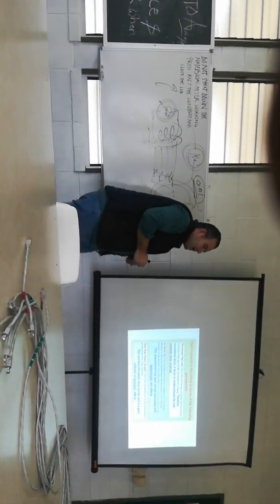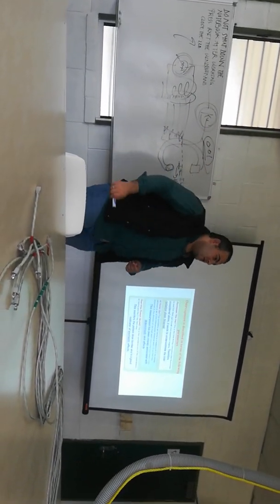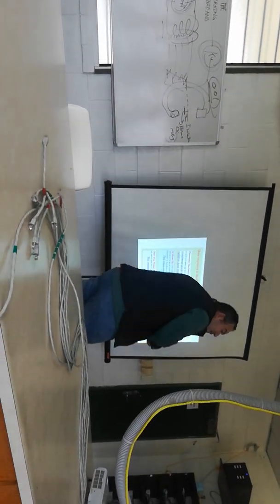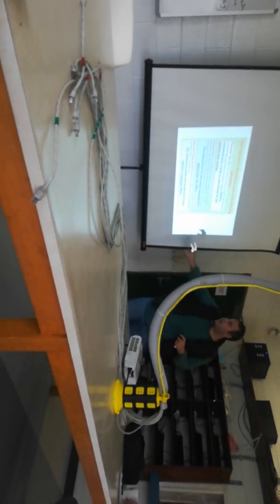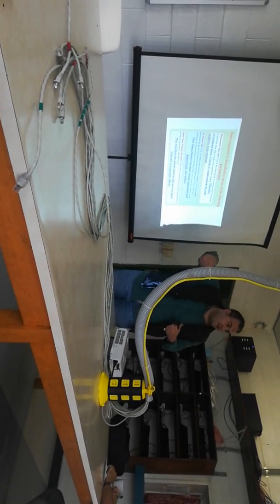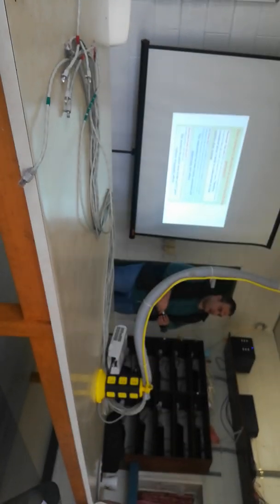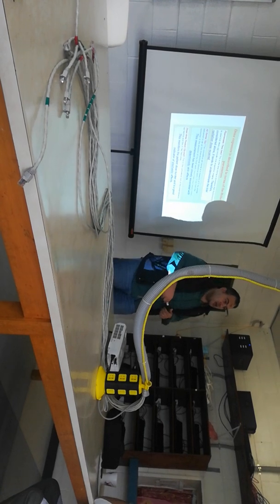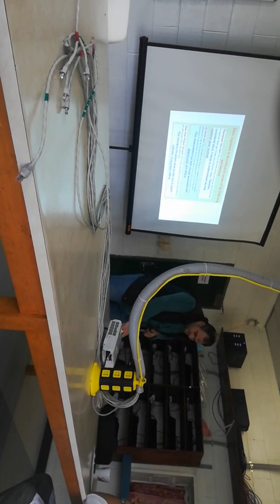So when I multiply the dose area product times 0.01, you can calculate the effective dose of the patient. As in our job in the operating theater, for extremities, you will find the effective dose of the patient.